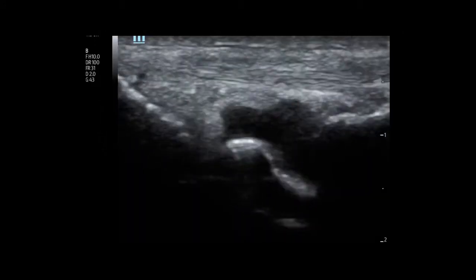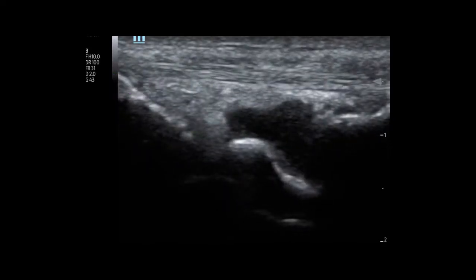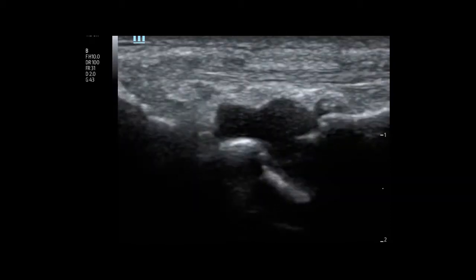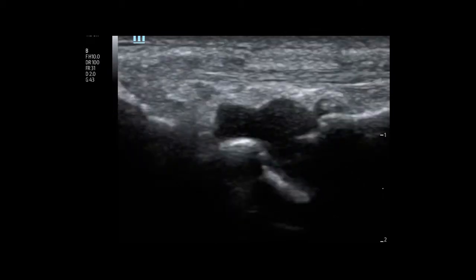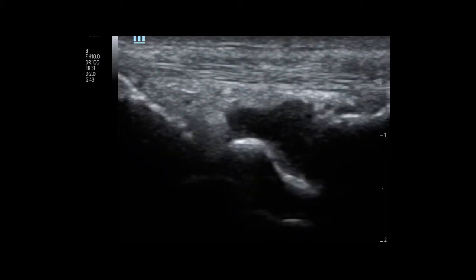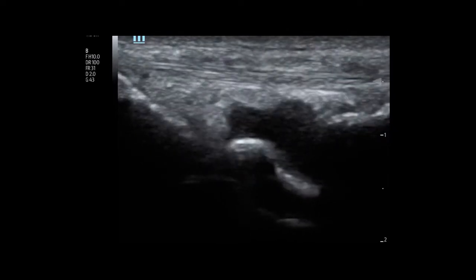With Dr. Wilson's patient, there now is a hypoechoic fluid collection in that same joint space that raised the concern for a possible septic joint. The fluid collection appears large on the screen here, but if you use the hash marks on the side, you'll notice this fluid collection is actually only about a centimeter by three-quarters of a centimeter.